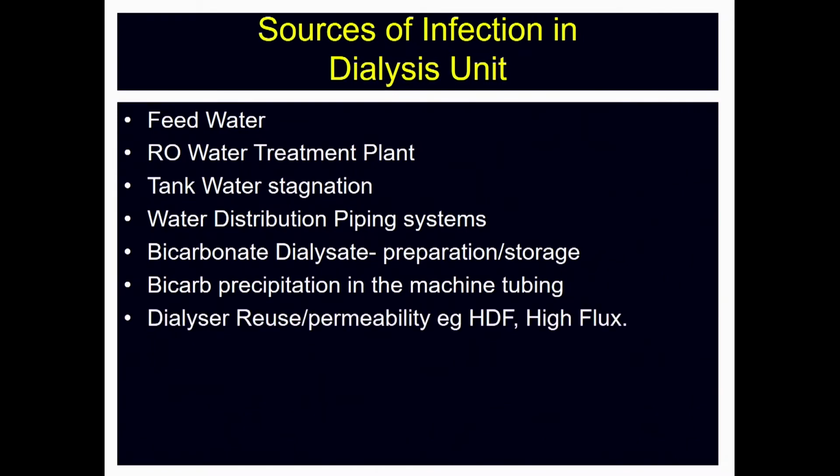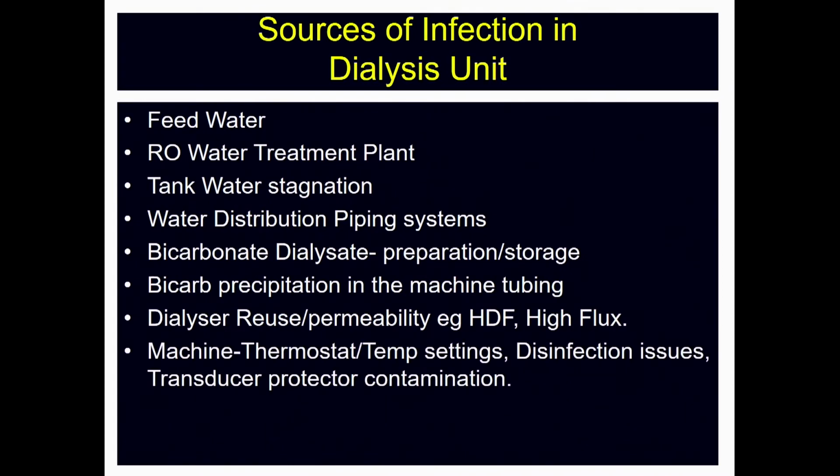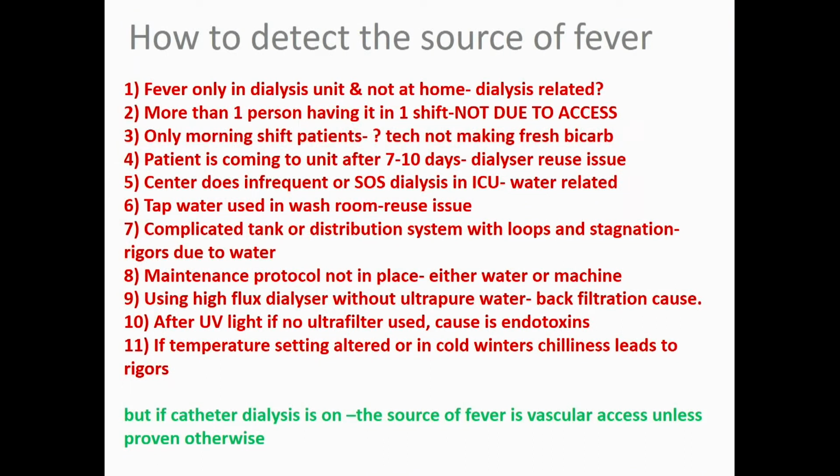Next. The dialyzer reuse we are all familiar with, how not a proper handling of the reuse format can lead to fever and chills. The machine, I think, is the area in many of these centers where there isn't much supervision: the transducer protector and the issues related to that. And of course, machine disinfection issues when you don't follow protocol. Now, how do you find what is the source of fever?